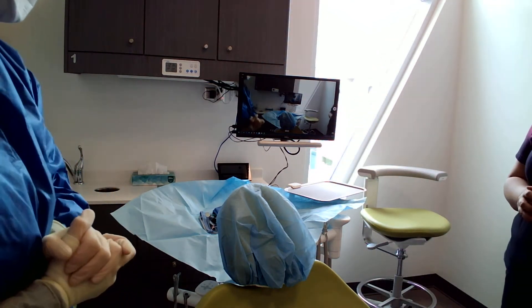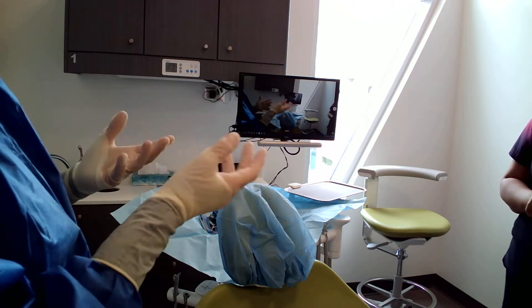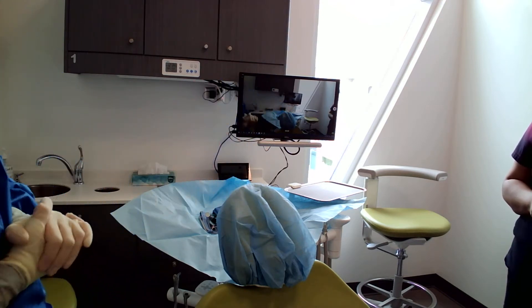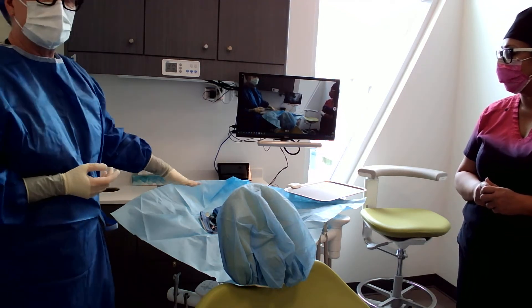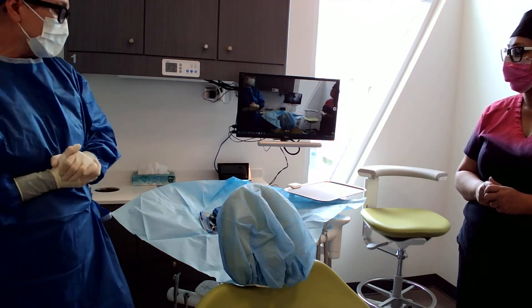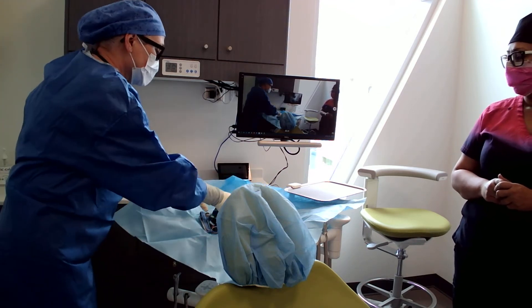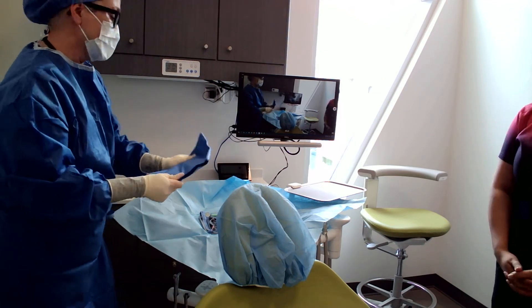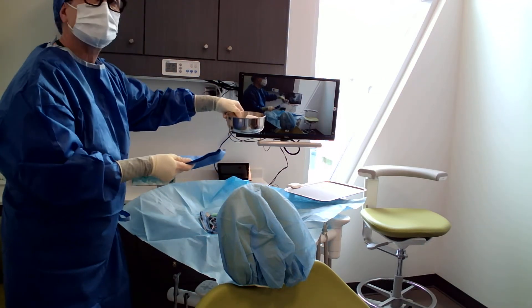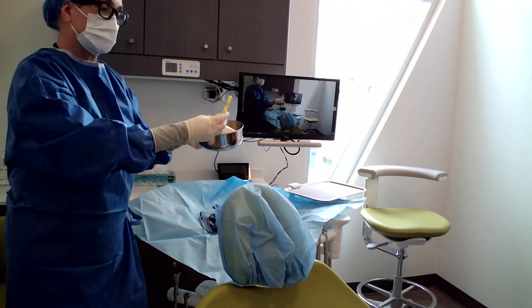We're going to open up sterile procedure today. I've got my assistant, my co-worker, Nina, helping me here. I've already opened up my back counter, and I'm not sure if you can see this in the operatory, but I've got my patient drape, my irrigation bowl, and pretty much everything I need for my surgery right here.